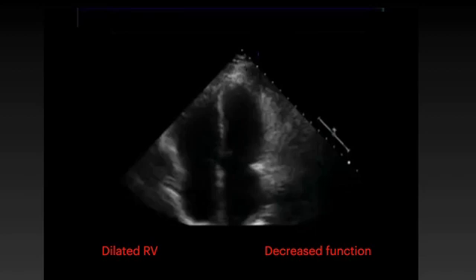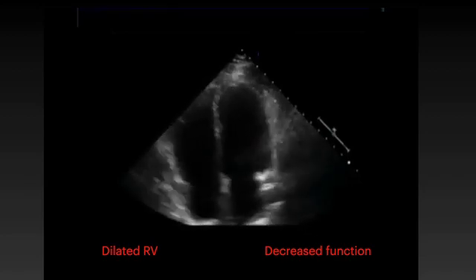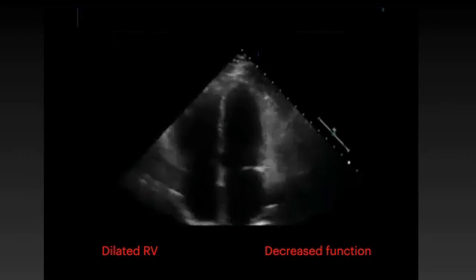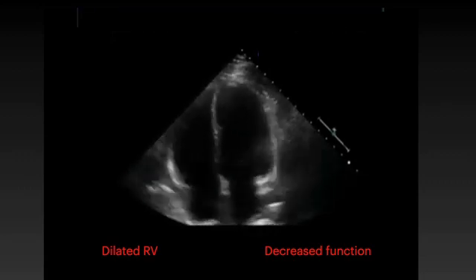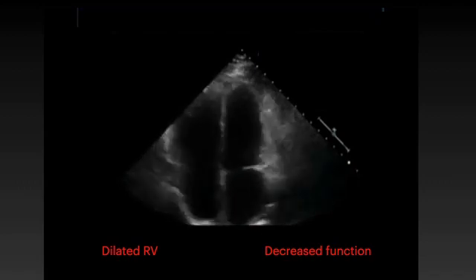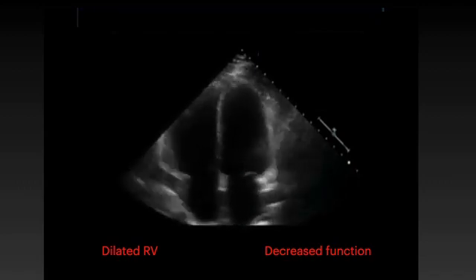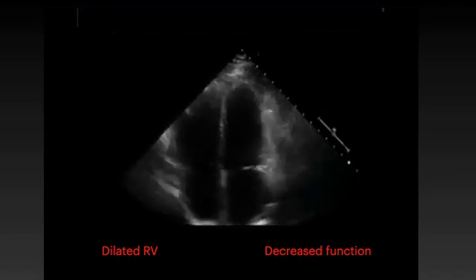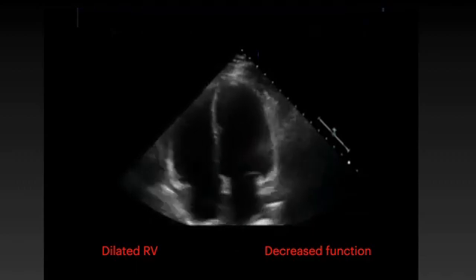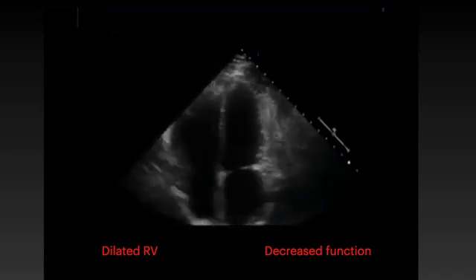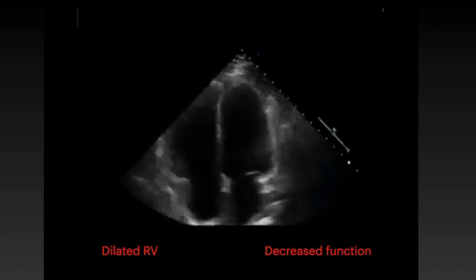The main findings of right heart strain in PE are a thin-walled dilated right ventricle that looks more rounded than triangular. When the RV gets big, it can cause the septum to move into the left ventricle. If the right ventricular wall is thick, it's more likely that the enlarged right ventricle is from chronic lung disease instead of something acute. You can also see decreased right ventricular function with right heart strain.